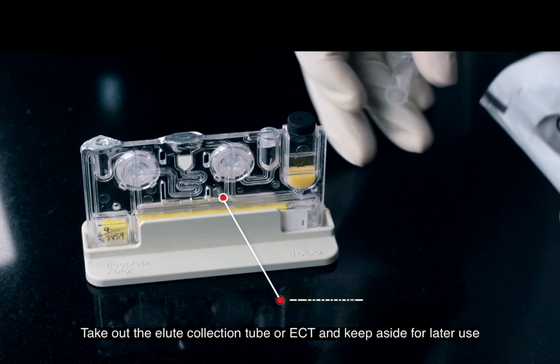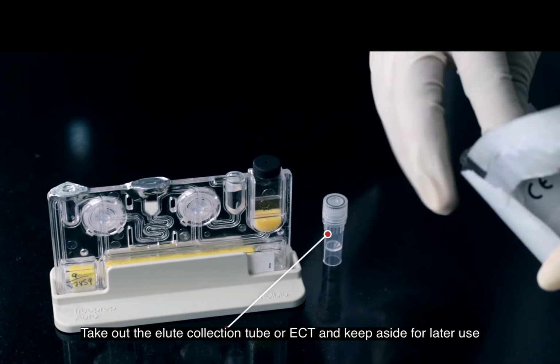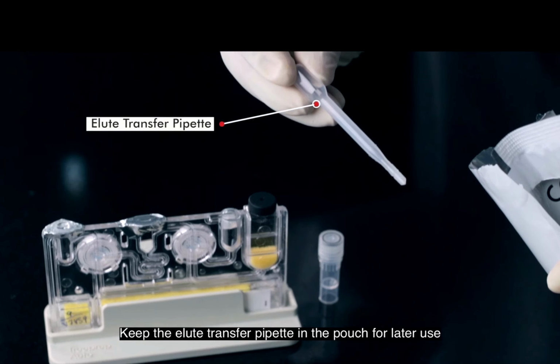The other end, you see, is covered with silver foil. So once you add your sample, the eluate will come at that particular part. So here you have an eluate collection tube. Once the eluate comes after your DNA extraction, you have to transfer it to this particular collection tube. So now here you have this pipette. So the eluate is there, and here you can see the silver foil. You have to use this pipette to pierce the silver foil and then collect the eluate and transfer it to this particular tube. Here you can see the lower part of the pipette, there is an edge.